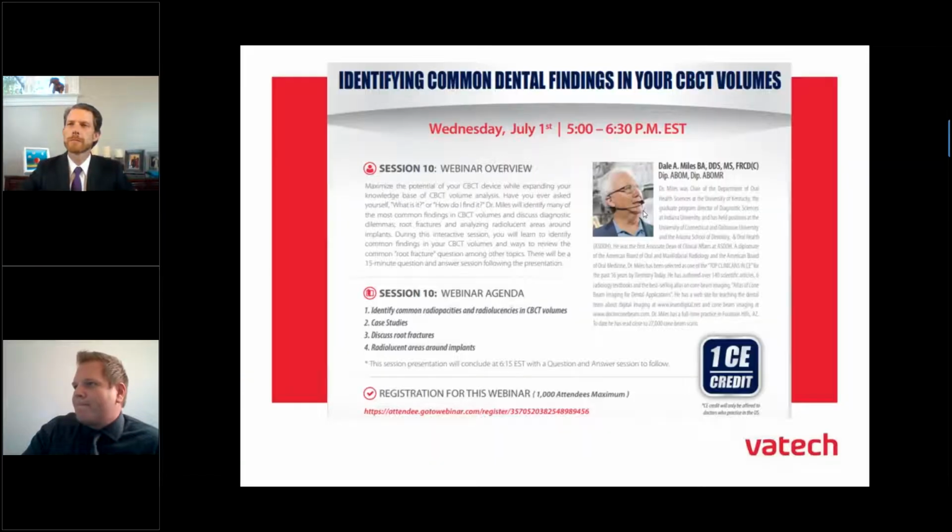Today's session, we get to look at common findings in CBCT volumes with Dr. Dale Miles. Our last session with Dr. Miles focused heavily on anatomy and CBCT, so I'm really excited about this presentation today. This will be our third session so far with Dr. Miles. And Jim, can you go ahead and share your screen? Yes. All right. Now we're going.